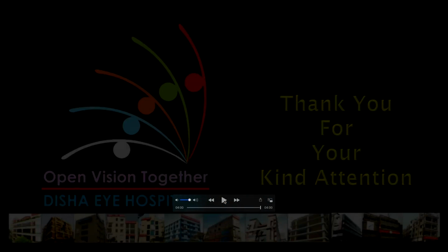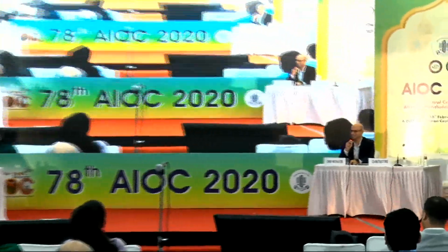Thank you. I think there were some wonderful tips there, and all aspiring and practicing DMEK surgeons would have learned something nice from that. I think the point of looking at the S in the cartridge and then putting it that way is useful.